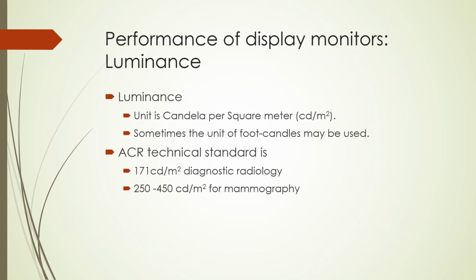For grayscale monitors for interpretation workstations, the current ACR technical standard for luminance is 171 candela per square meter for diagnostic radiology monitors and 250 to 450 candela per square meter for monitors used in mammography. There are currently color LCDs providing more than 400 candela per square meter of luminance.